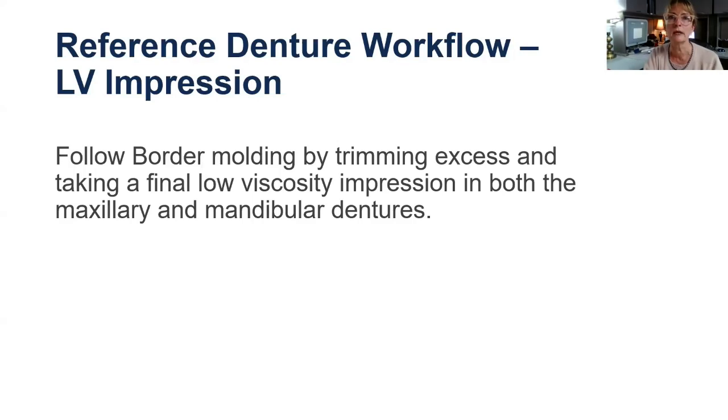See, another question came up. Especially for patients with flat ridges, yeah. Yeah. Again, it's displacing the tissue. You need to be able to displace the tissue in one way or the other in order to capture the ridge that is still there.